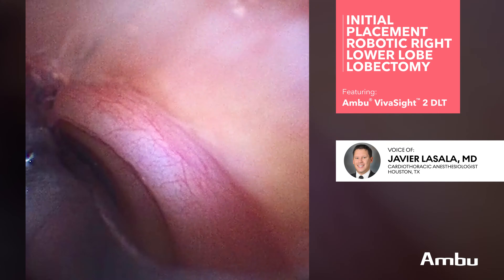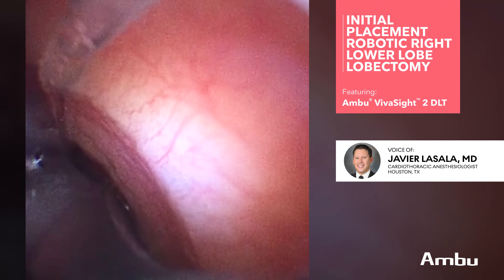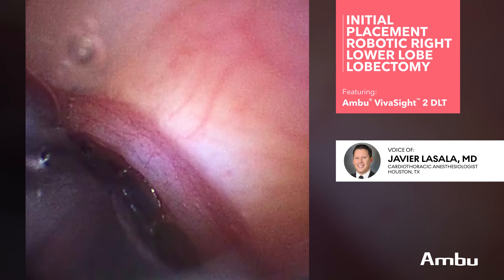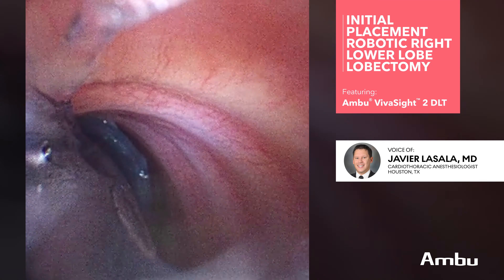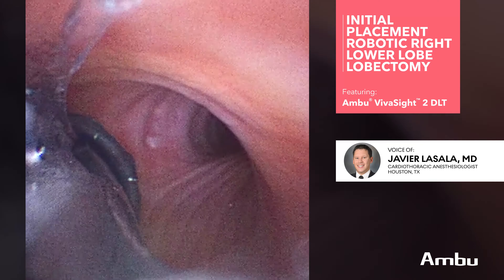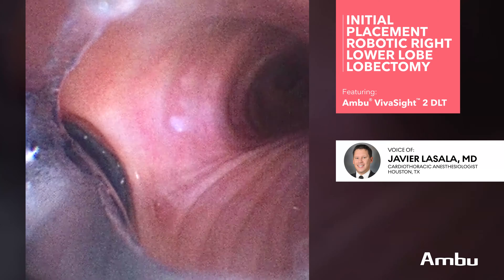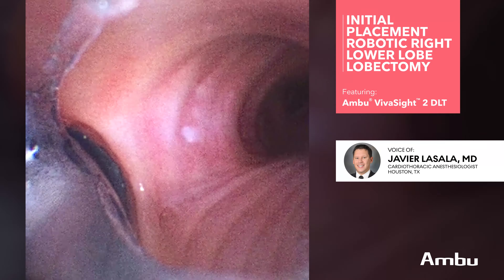Moving slowly through the tracheal rings, we go from 12 o'clock to 1 o'clock to 2 o'clock position and the 3 o'clock position at our landing site of the carina — perfect video double lumen placement.